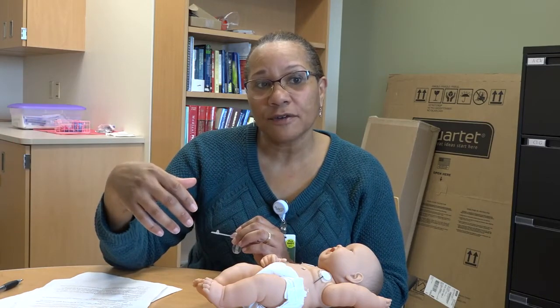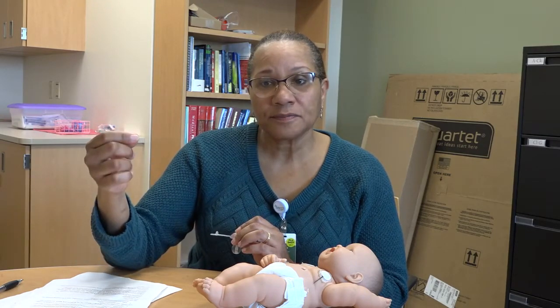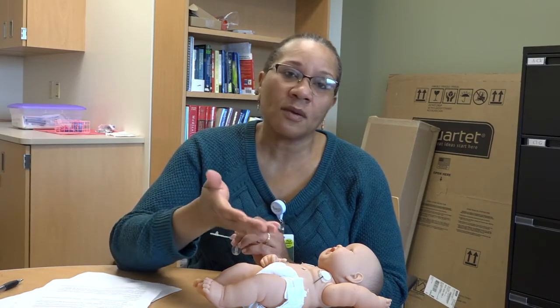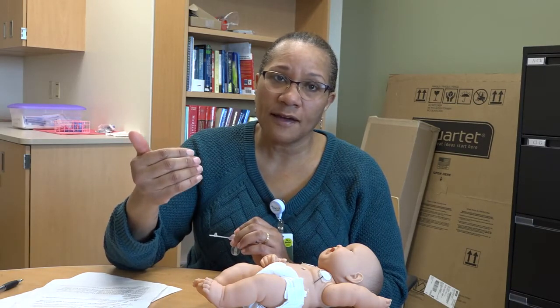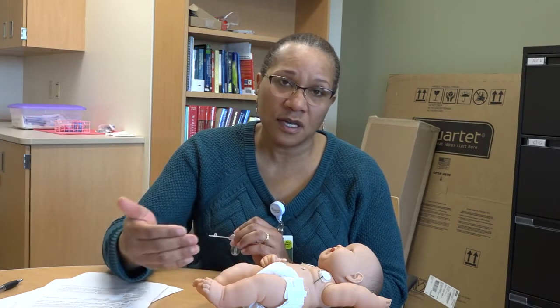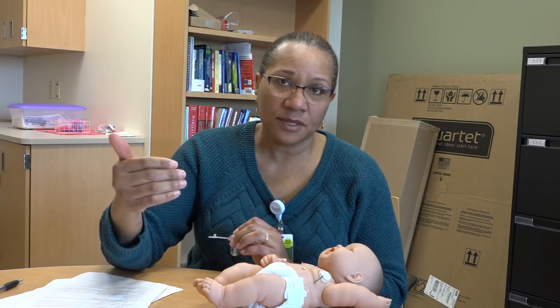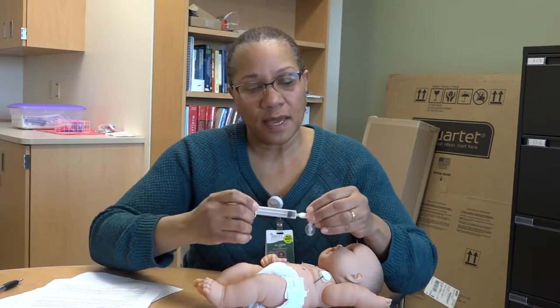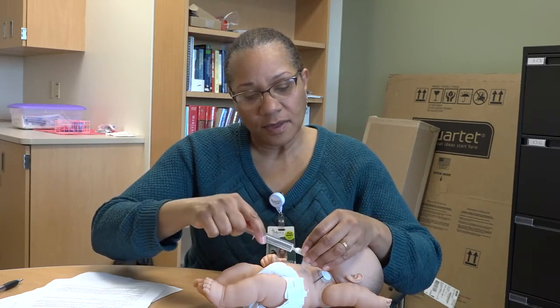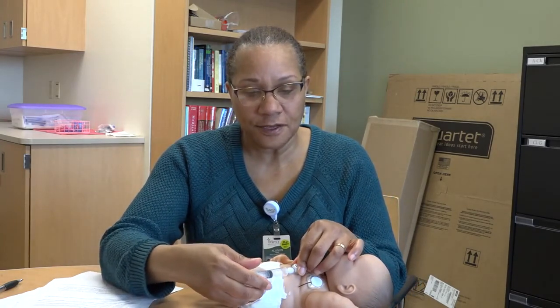So if your baby is doing oral feedings first, and then you're feeding the rest through the G-tube, depending on how much is going through the G-tube, you may not need to vent very much because you're probably burping when you're doing your oral feedings. For babies who are having all of their feedings go through the G-tube and aren't taking anything by mouth, then using the venting method is probably going to be more effective. So I will show you what that looks like. While you're here in the hospital, you may see nursing staff venting after a feeding.